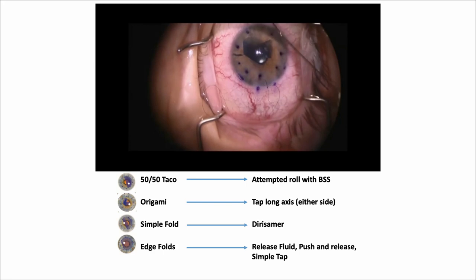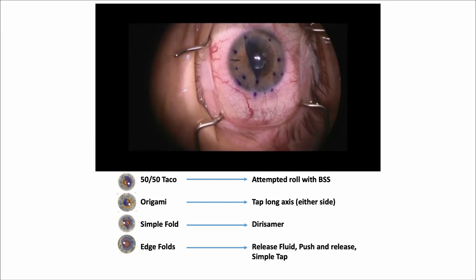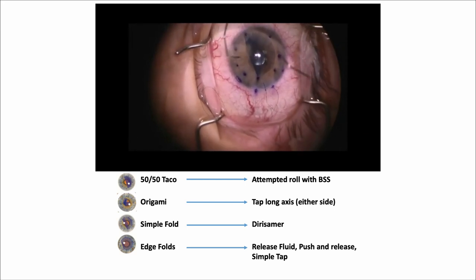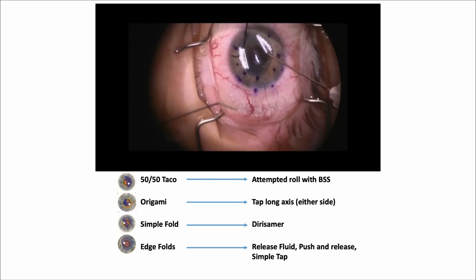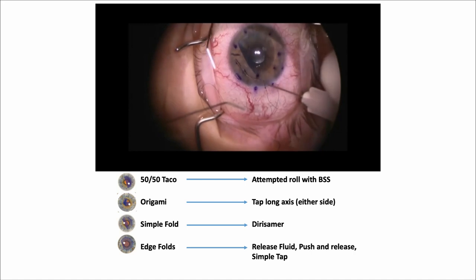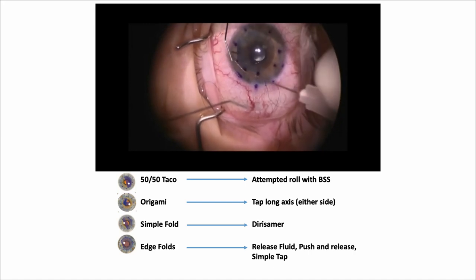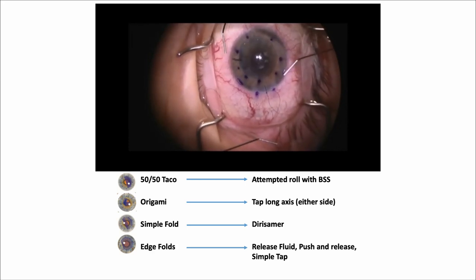Let's watch this — a 50-50 taco. Attempting a roll with BSS, now it looks like origami. Tap the long axis on either side — tap, tap, tap — and now you've got a simple fold. What do we do there? The Derisamer technique: holding pressure with one cannula, tapping with the other. Then a little bit more fluid, holding pressure there, tapping with the other — there's the Derisamer technique. Now you have a little bit of an edge fold — just release the fluid, push and release, a little simple tap, and that opens it right up. Dr. Veldman shows that you can combine all these techniques: taco to origami to fold to edge fold all at once.